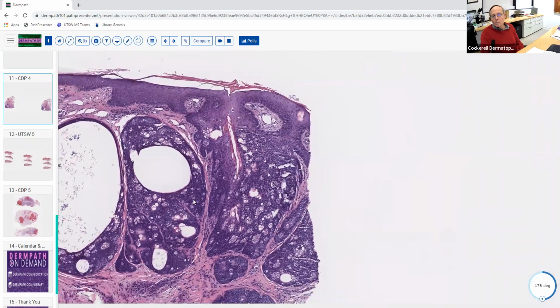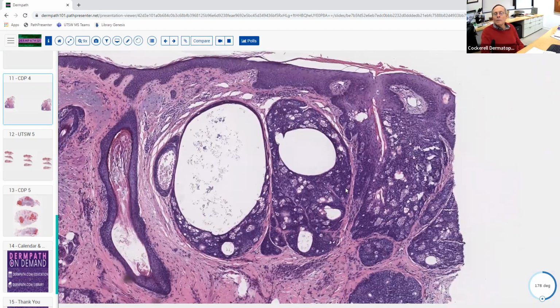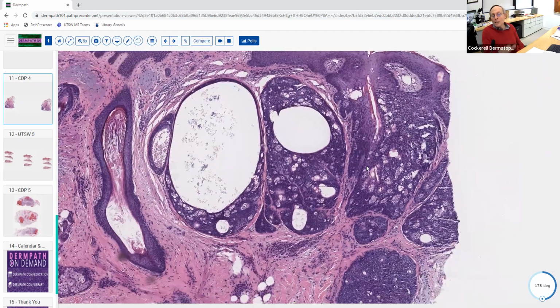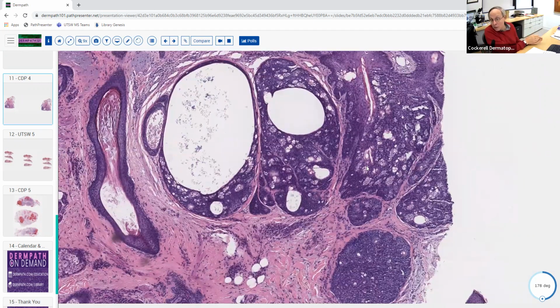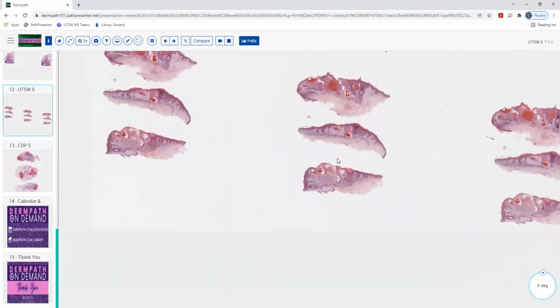So you can do some stains looking for microsatellite instability. That's one of the things we do to kind of screen for that. But this is a sebaceoma. The other one is another benign lesion of sebaceous differentiation, the Fordyce spot. Okay, and then there's the sebaceous adenoma, which is kind of in between those. Okay, great. All right, we got one more to do.